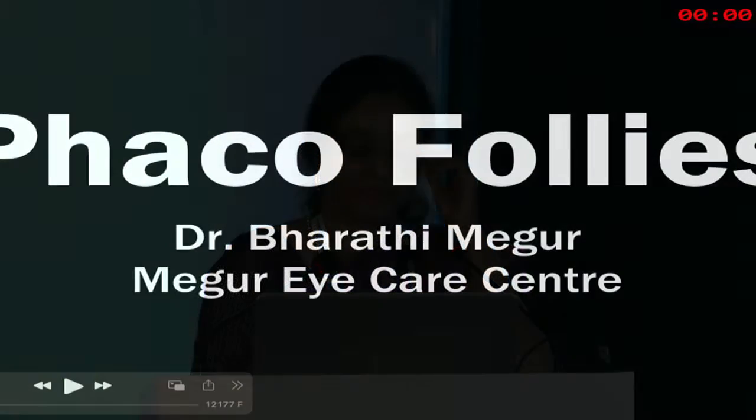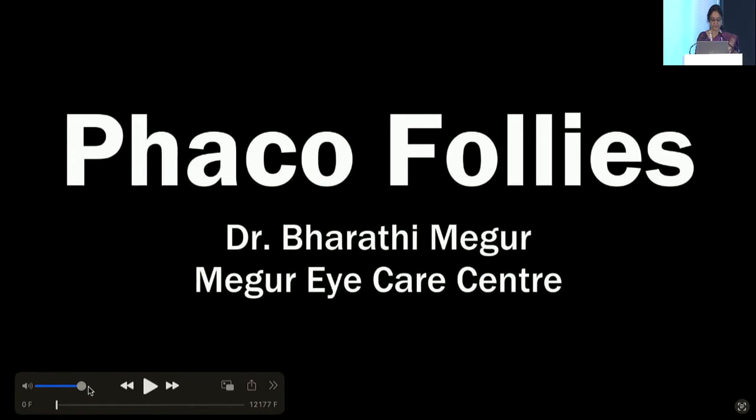Yeah. So good morning everyone. I'll be just showing 3 videos, and these are all related to the posterior capsular problems.